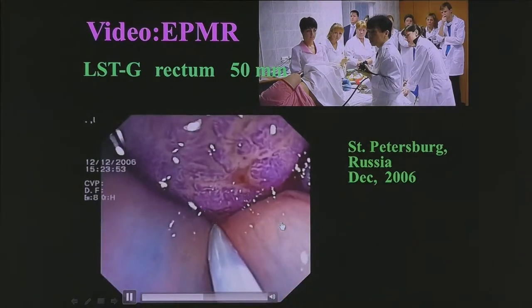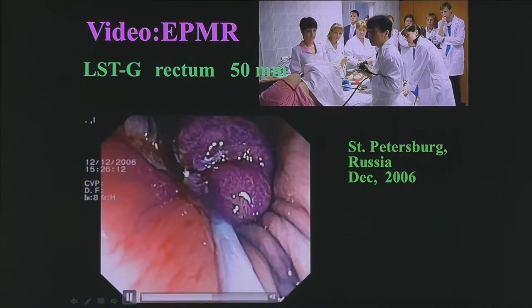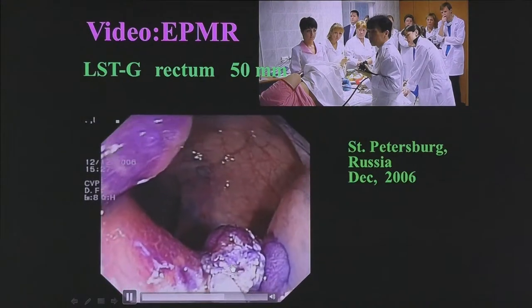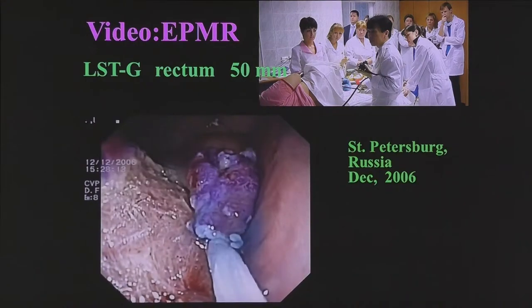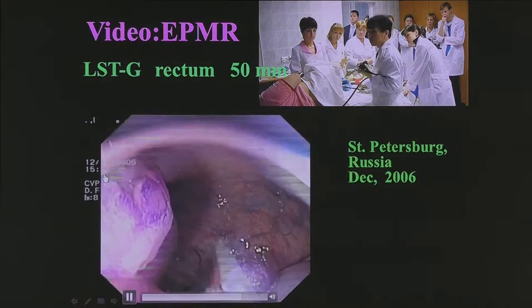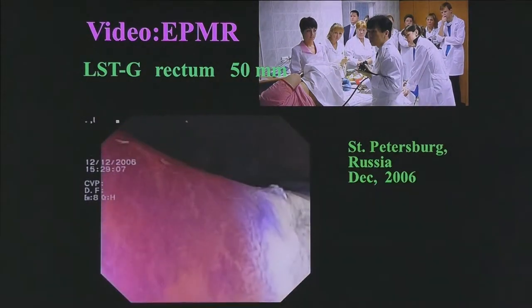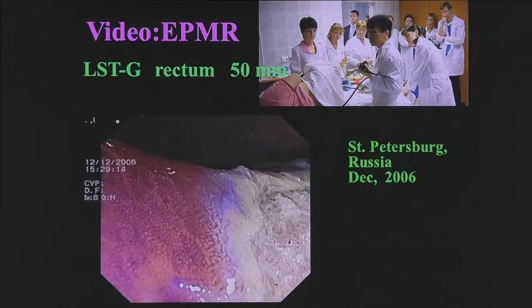So it was the first cut. I removed about 3 centimeters. And this is the second cut. And third cut. And this is the fourth and final cut. So it was 3:28. So it took only 8 minutes for the injection and the resection of the total lesion. So piecemeal EMR is very quick and is not bad.